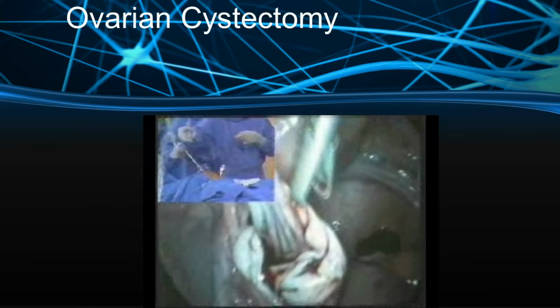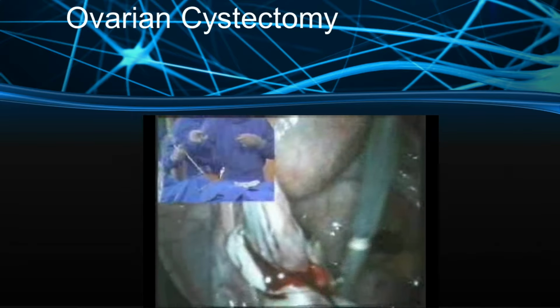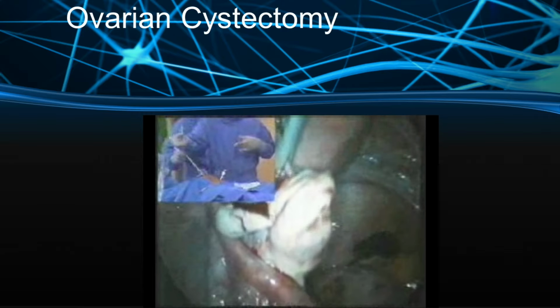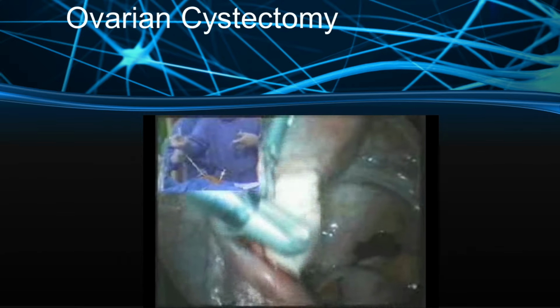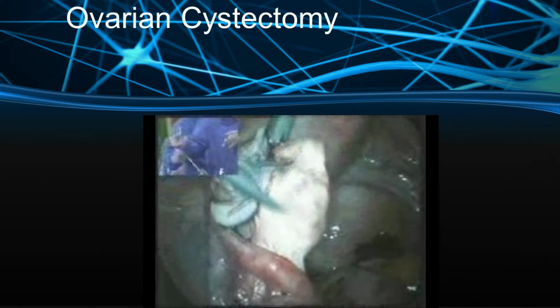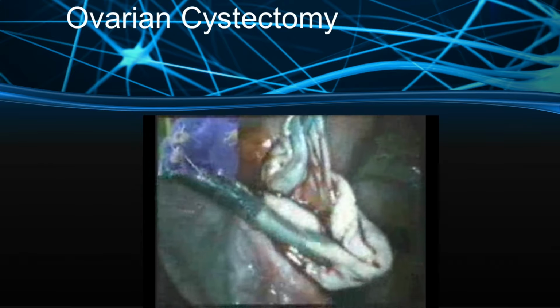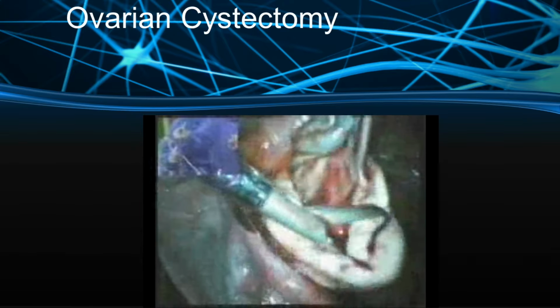Is it always better to decompress and then do cystectomy? Generally in our practice, unless it is dermoid cyst, we always decompress. In cases of dermoid cyst, we should avoid, otherwise you should decompress.